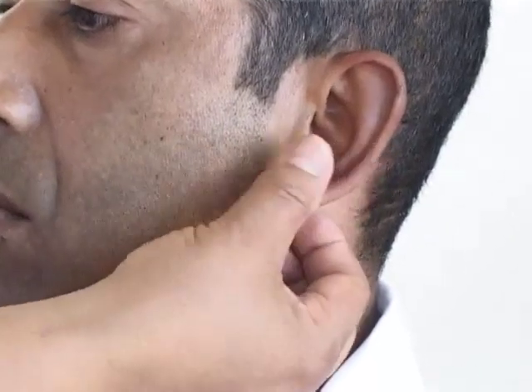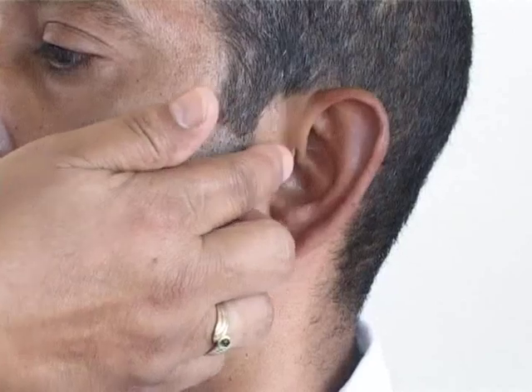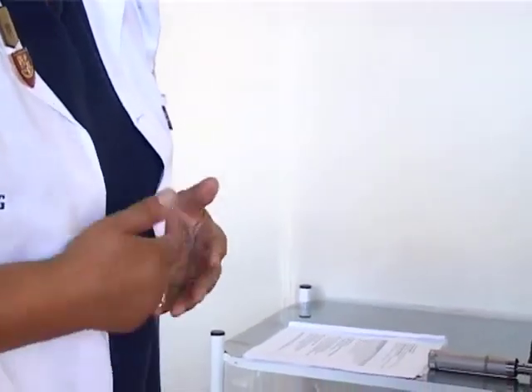we apply pressure on the tragus to feel if there's any tenderness or pain, which will give an indication of an external otitis externa. Okay. We go on to the examination of the internal ear, which will include the examination of the external auditory canal with the otoscope.